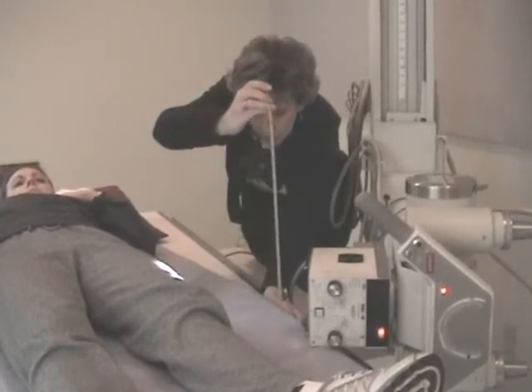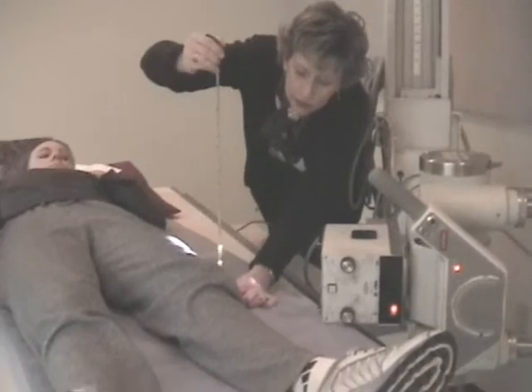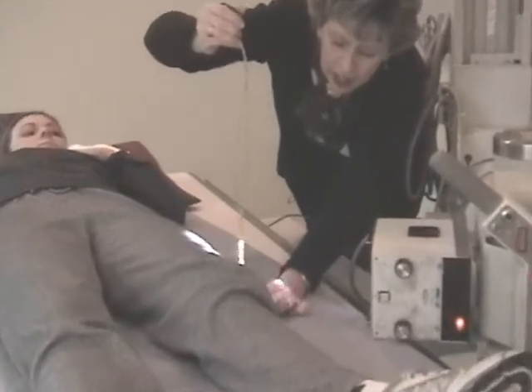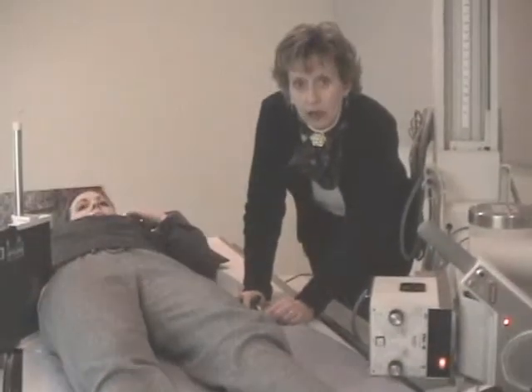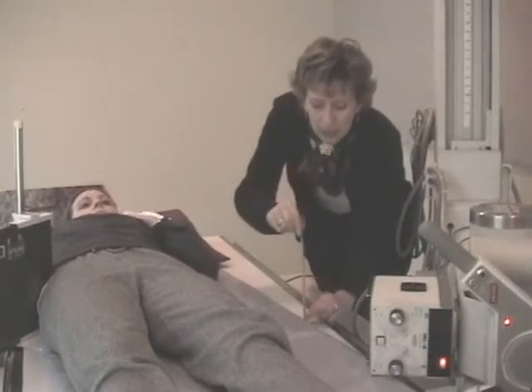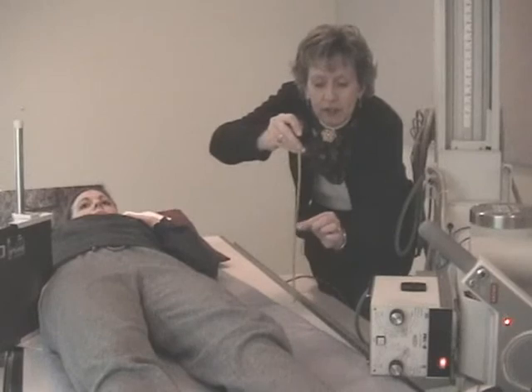Measure from the tabletop up, and can we see the light? Okay, I can't go underneath the pad and show you, but I've got to go down below the pad, use your tape measure, and the crosshair from the center of your tube should be at the 5.5-inch mark. That will let you know that you're right to the center of the grid. Again, you're measuring from tabletop into the light source, and it should read 5.5.